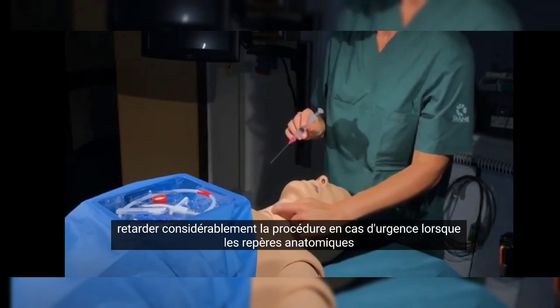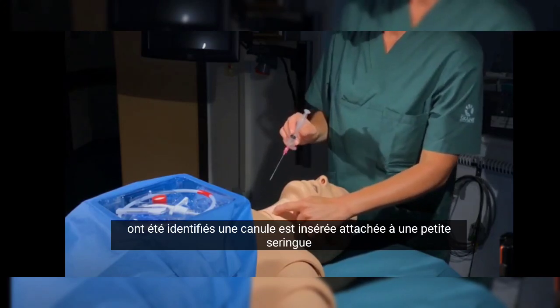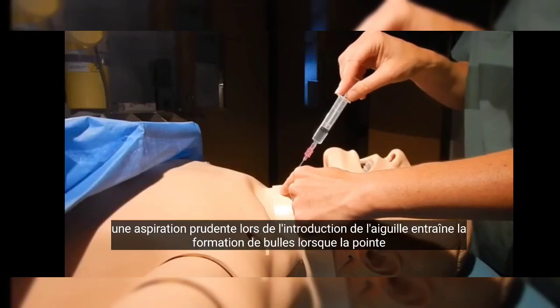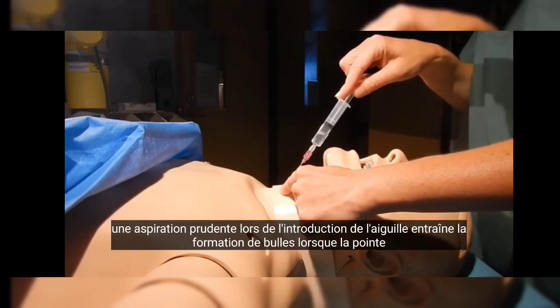When the anatomical landmarks have been identified, a cannula is inserted, attached to a small syringe filled with a small amount of saline solution. Careful aspiration when introducing the needle results in bubbles when the tip reaches the trachea.